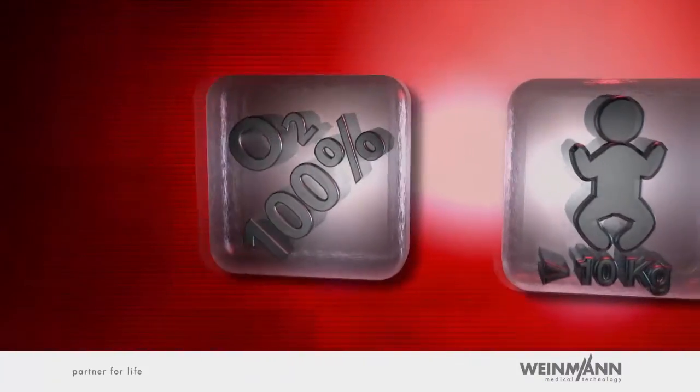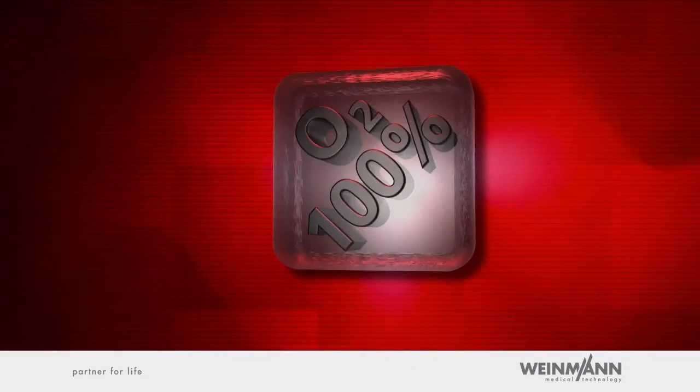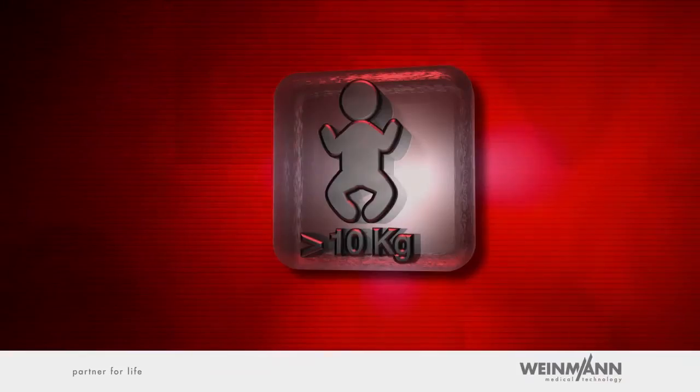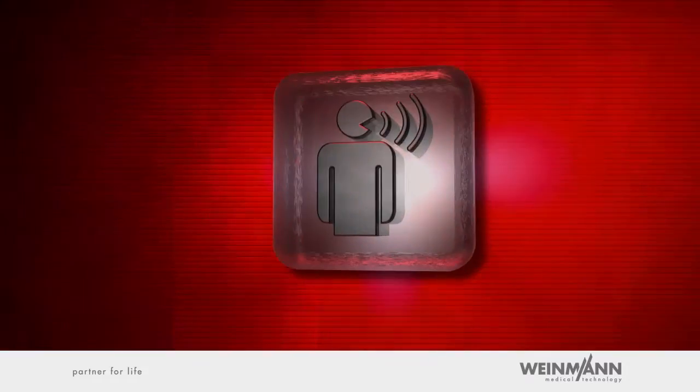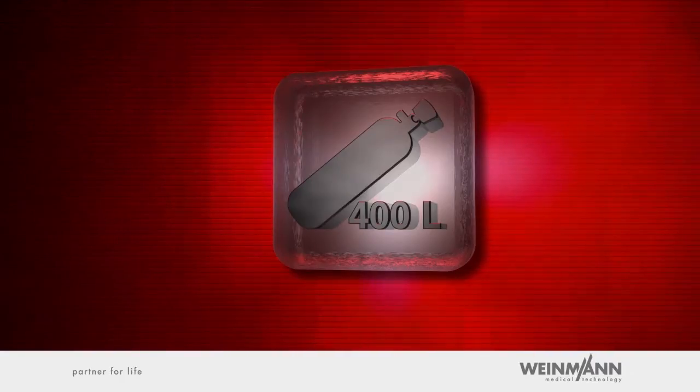The main areas of use and features of the complete system Mejumat Easy on LifeBase 3 are: 1. Providing inhalation therapy with 100% oxygen to spontaneously breathing patients by means of the innovative demand flow mode. 2. Treatment of respiratory arrest with emergency ventilation of adults, juveniles and children weighing at least 10 kilograms. 3. Support of Mejumat Easy users provided by the world's unique voice prompt function. 4. A comfortable option for carrying 400 litres of oxygen.